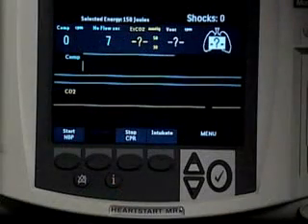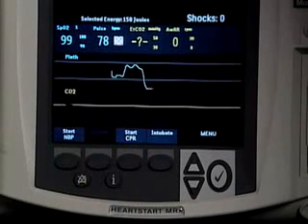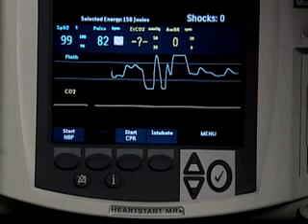If CPR is not needed, the CPR subview can be turned off, and wave sector 3 can be used for another parameter, for example, SpO2.